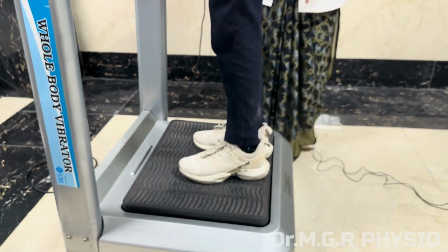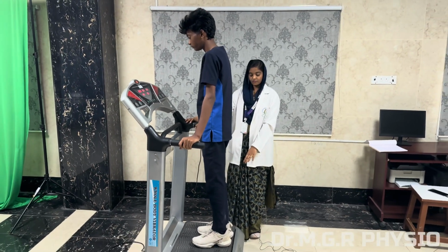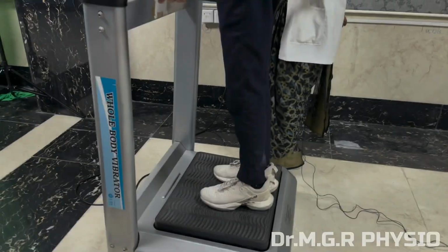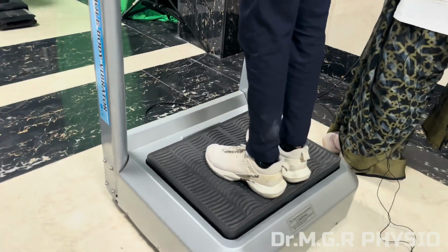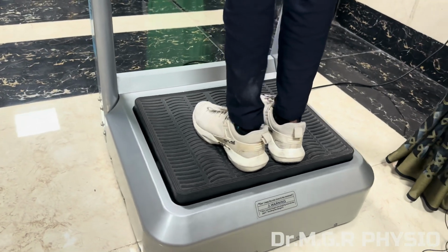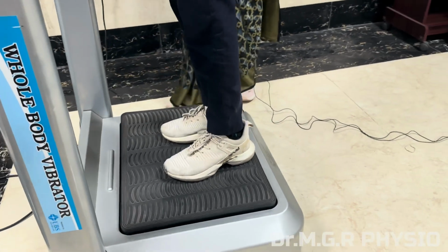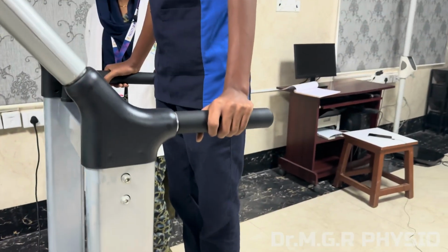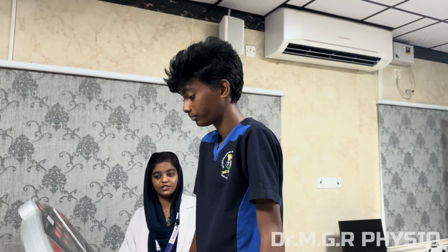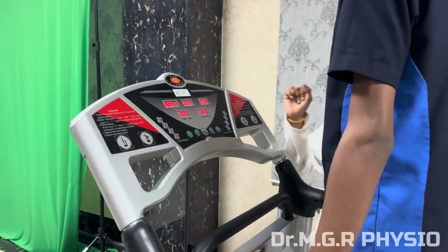This is how the vibrations are transferred from the vibrating platform to the person using the whole body vibrator. If there is any sudden emergency or the patient feels discomfort, we can immediately stop the usage of the machine.